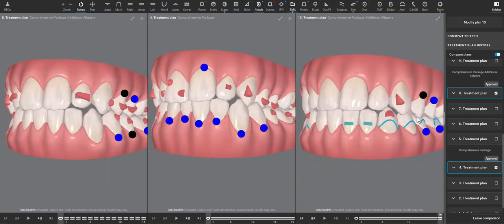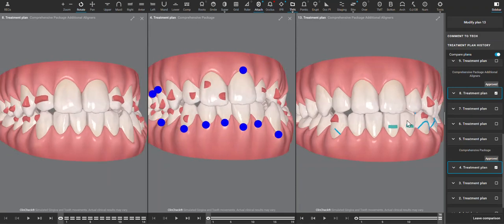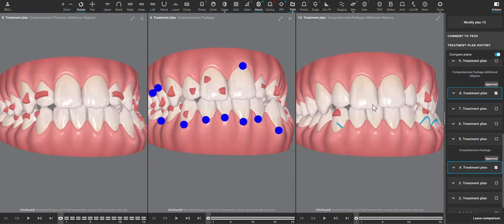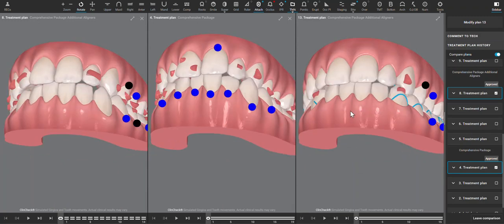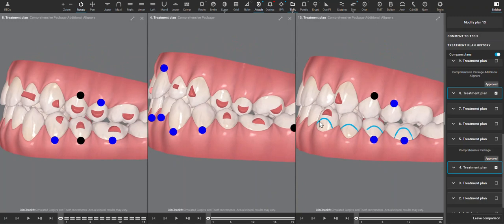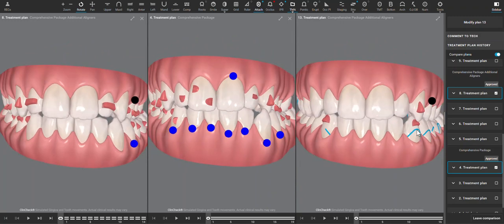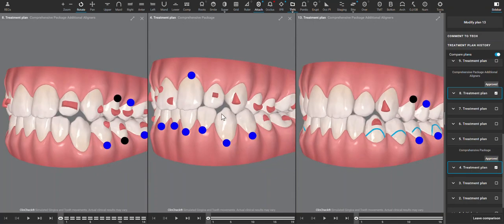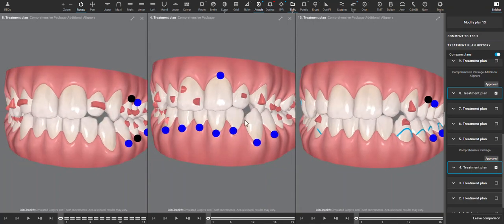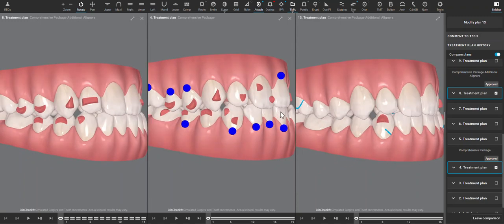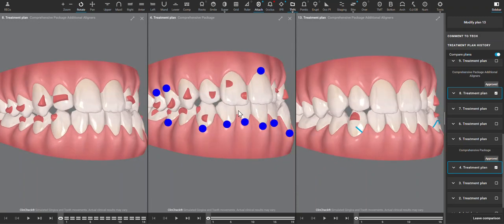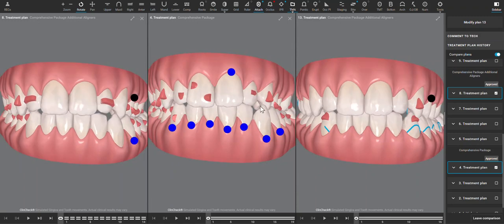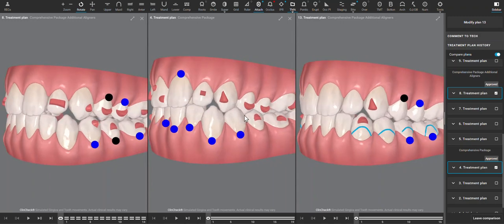Hi, I'm looking at this refinement ClinCheck, and whenever looking at a refinement and a posterior open bite, I always want to look at the initial ClinCheck to see the initial presentation of the patient, where they're coming from, where we're at now, what movements were intended to happen, which ones worked well, and which ones did not work well.